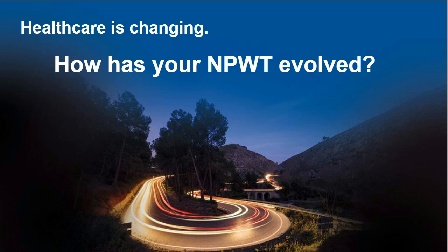Great. Thank you, Emmy, and always good to get questions coming right off the bat for these sessions. Obviously, I think Peg will have some input to this, but from my anecdotal experience, what we're seeing is the ability to remove the fluid more quickly and thereby return the wound to the set pressure more quickly through a patent system. The inference that we're making at this point in time is that you can get back to the mechanisms of action and deliver on those more quickly and more consistently. Anecdotally, I've seen personal experiences with patients who maybe have lymphedema or are on skin grafts where it's absolutely critical, or you have challenges of excess fluid, where the dynamic exudate removal and the ability to remove fluid more quickly has been beneficial. But maybe Peg, if you have some thoughts around that as well, it might be interesting to hear from a clinical perspective.